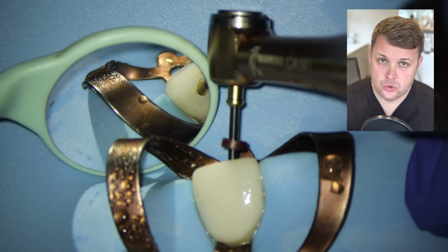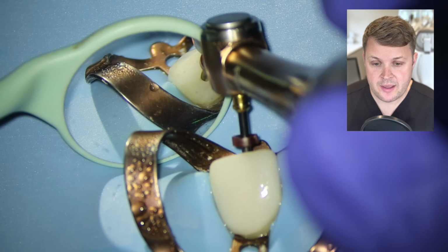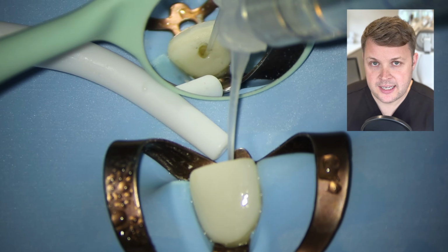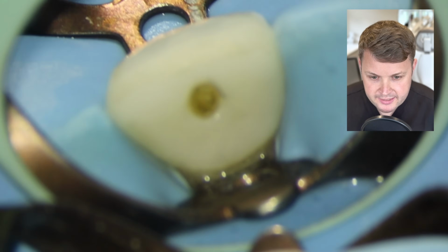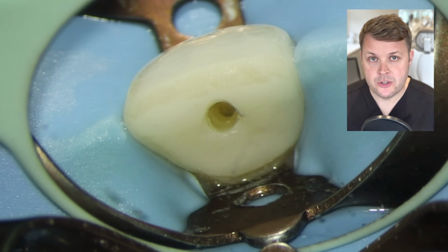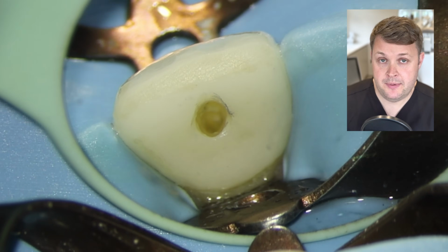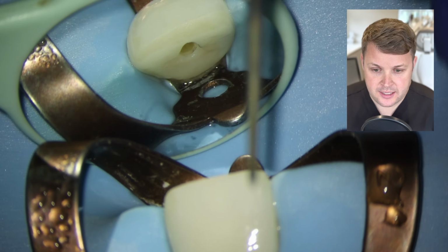So this is quite a short rotary file, but it's quite a high taper, so it's quite fat. So it's going to open out the canal orifice, and we'll give it another little bit of irrigant, and then we can see that we've breached the pulp chamber, but the hole is still too small. There's overhangs here. This is going to be incredibly difficult for you to shape, clean and obturate with the hole and the access in this situation.